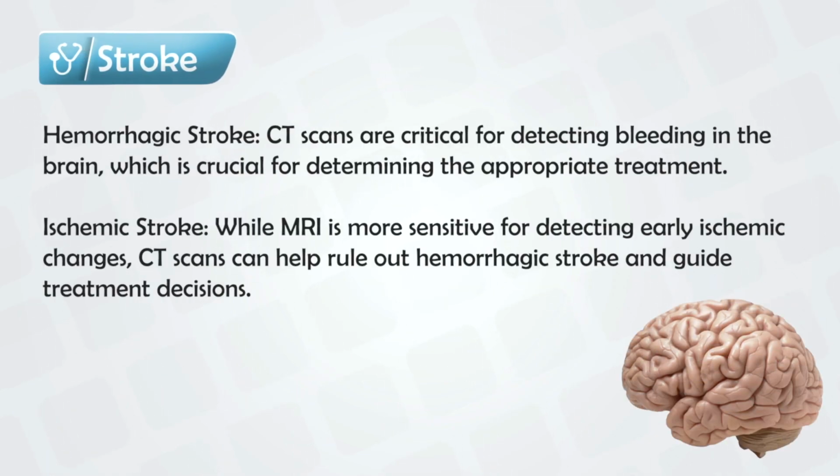In cases of stroke, you need to act very quickly. While MRI remains the best tool for detecting early signs of brain ischemia and strokes, it takes time to do and it's not often done in the emergency department. CT can be used to rule out the hemorrhagic strokes, which often requires neurosurgery intervention.